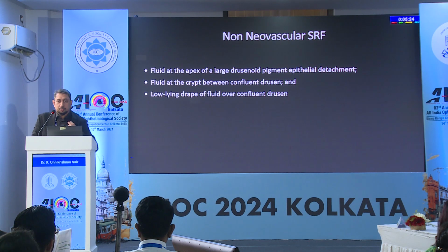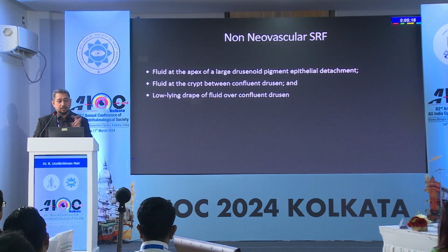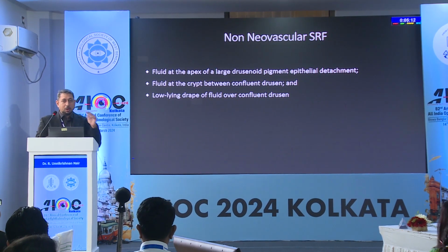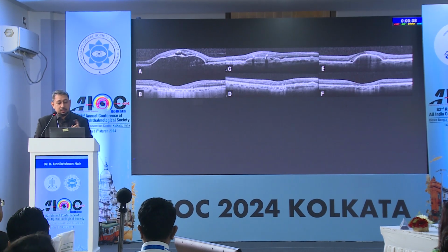And then the next circumstance, non-neovascular SRF. You have SRF, but it is not neovascular in nature. If you have fluid on top of the PED, fluid at the edges, the draping of the PED, or a blanket between two PEDs, this is called non-neovascular. So these are the examples.